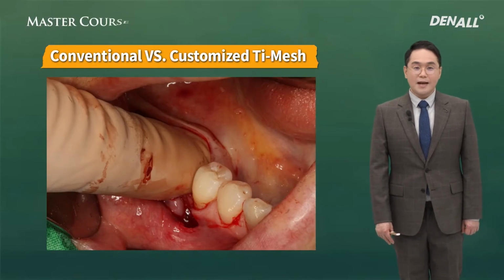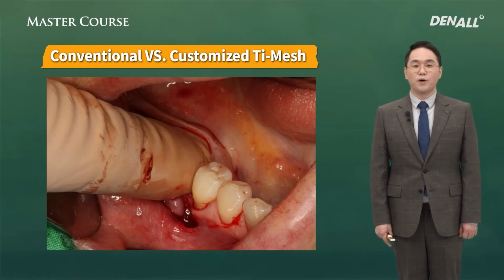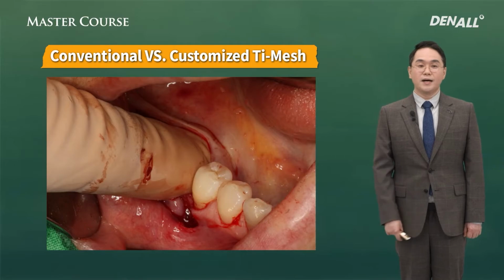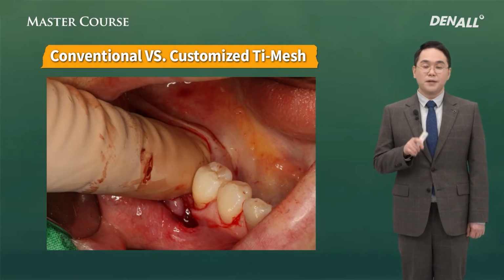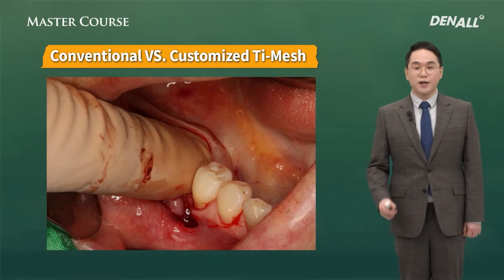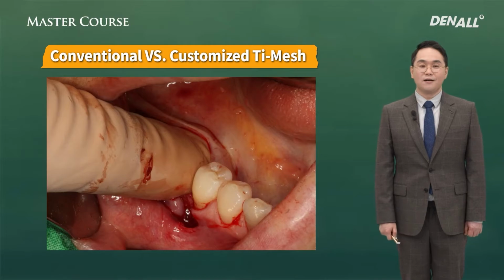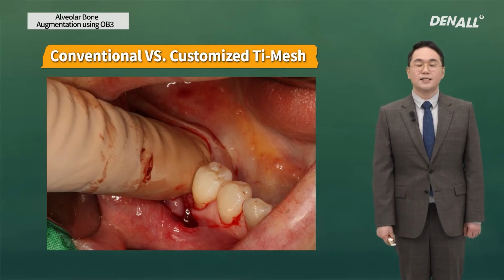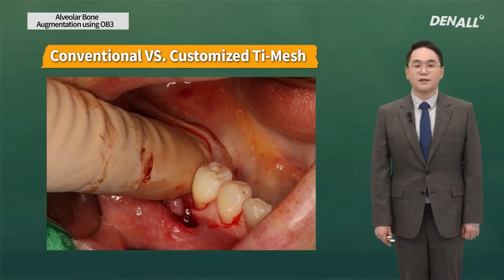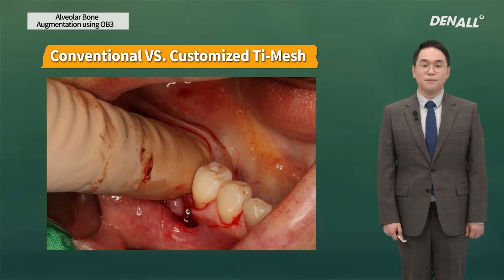According to Dr. Picos, in the mandibular posterior, not only the buccal flap but lingual flap can be advanced coronally. Using a finger like this, you can dissect the lingual flap below the mylohyoid ridge. The lingual flap can be advanced coronally a little bit. When you do GBR for vertical augmentation in mandible, lingual flap dissection can achieve the primary closure rather easily.